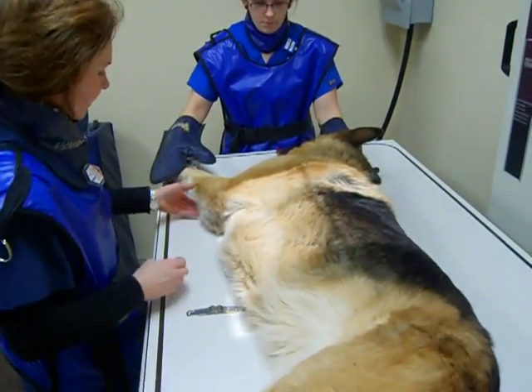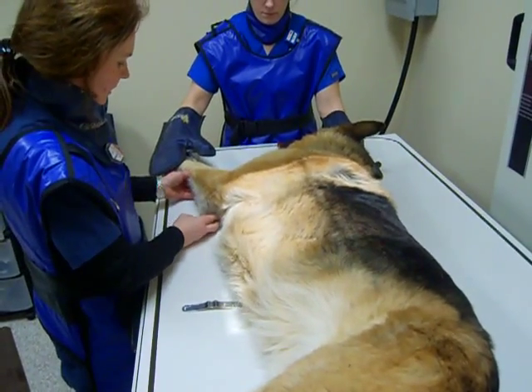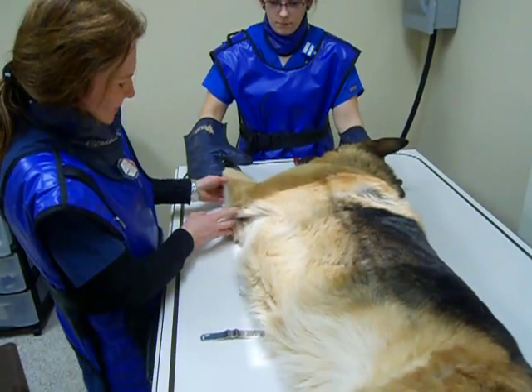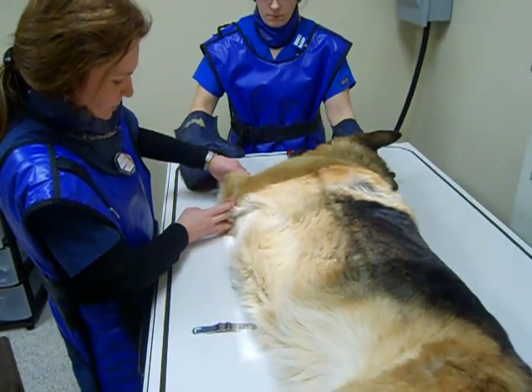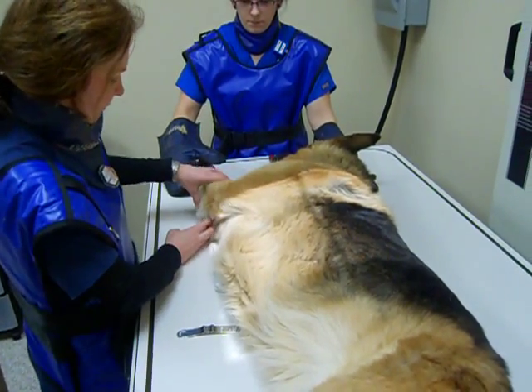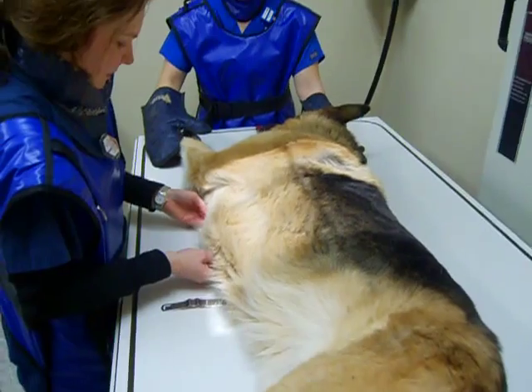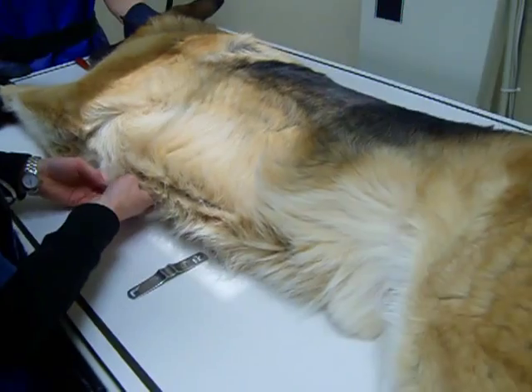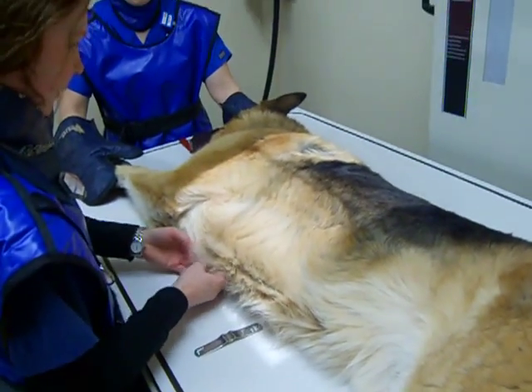For a right lateral recumbency, I would make sure that we pull the front legs back cranially to make sure there's no superimposition over the cranial lung field. To ensure there's no rotation, I'd place a wedge pad to support the sternum.